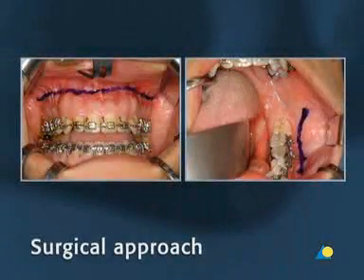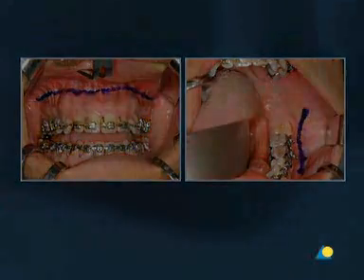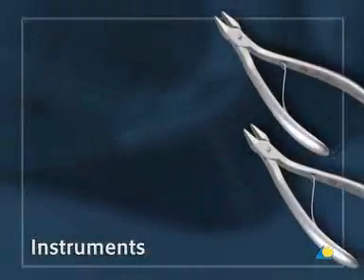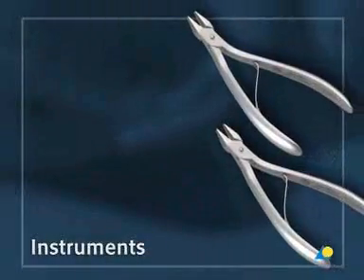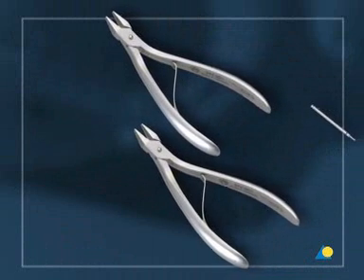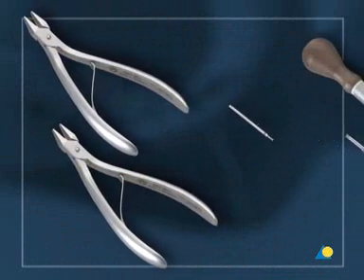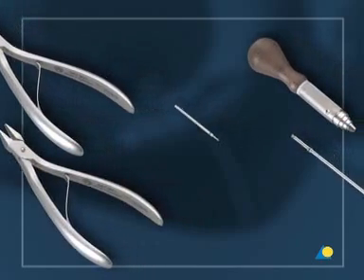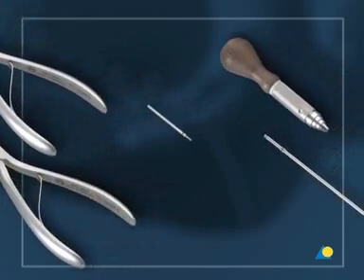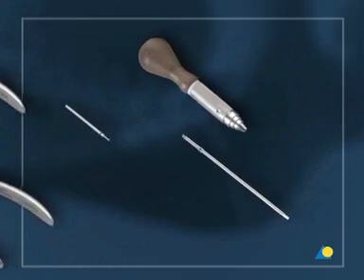In a clinical situation, access to this fracture would be through an intra-oral approach. In this exercise, the instruments needed are two bending pliers, the 1.5 mm drill bit with 6 mm stop, and a star drive screwdriver shaft with handle.